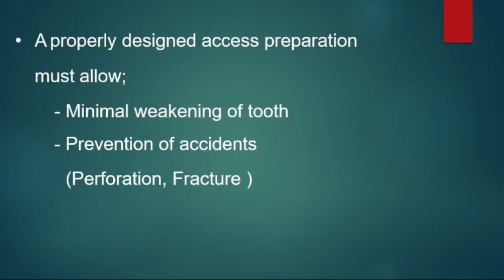So an adequately designed access preparation should allow the following. Number 1, it should be very conservative with minimal weakening of the tooth. And number 2, it should prevent unfortunate accidents like perforations when locating canals or fracturing instruments when preparing them.